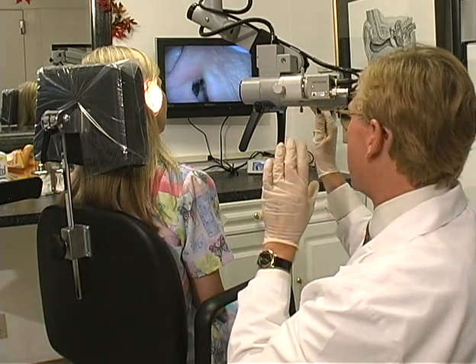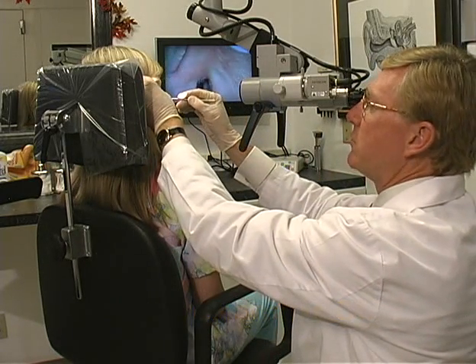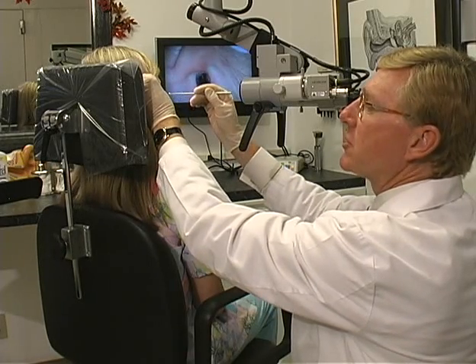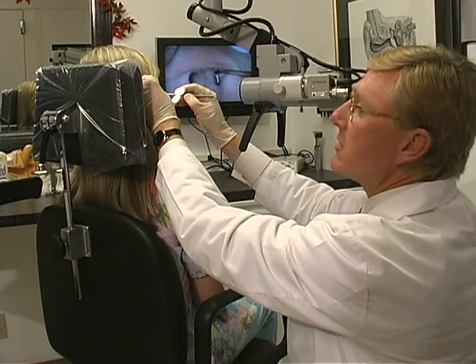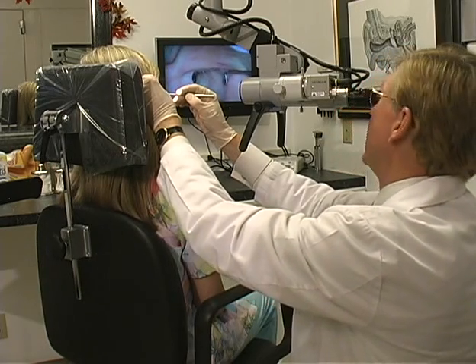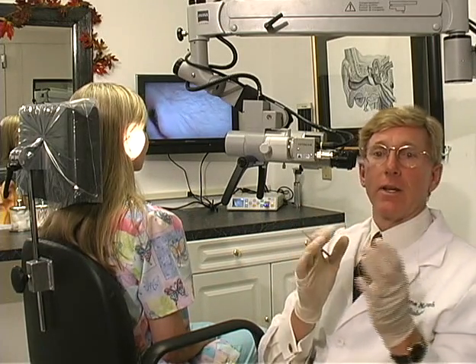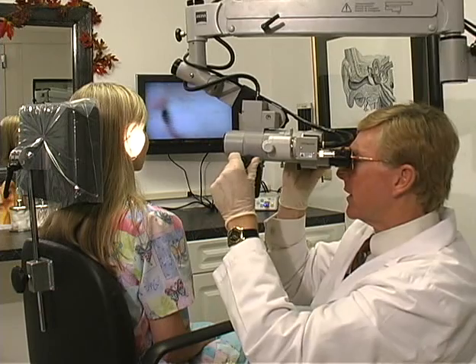Now you and the patient see the same thing. Begin the ear examination and, if necessary, cerumen removal. You'll notice that after the microscope is stabilized, your hands are free to pull back on the patient's ear and secure their head position while using the other hand to insert and manipulate your instruments. If you're not using the speculum and don't need to, you can push back on the tragus with your instruments to provide an adequate view of the ear. It'll occasionally be necessary to readjust the focus as patients move or you need another instrument — just adjust the handles towards and away from the patient until you get good focus.